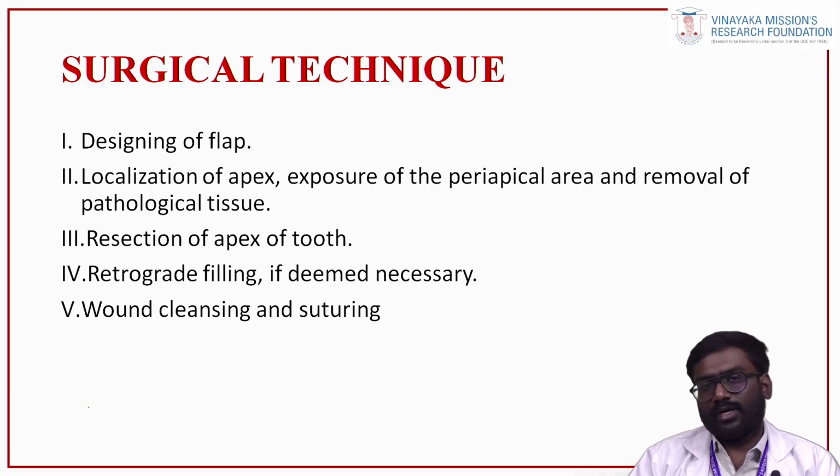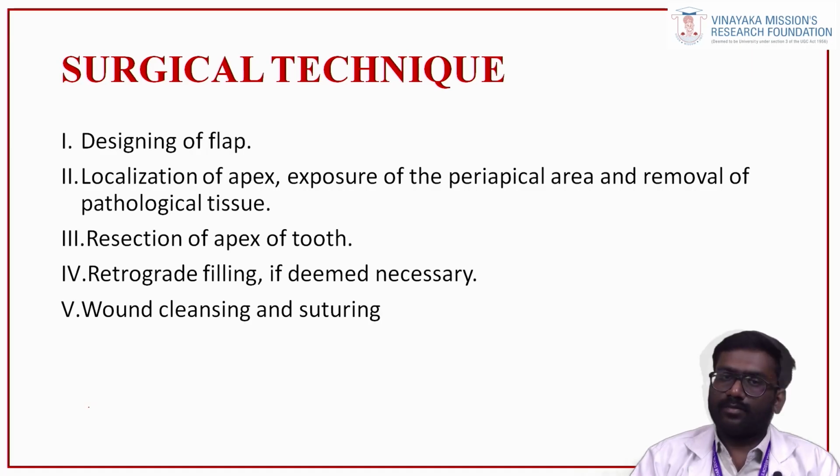Once you have located the periapical region and its contents, the next step is to remove all those infected tissues. Once you have clearly removed them, the next step is to perform a root end resection. After that is the retrograde filling, followed by wound cleansing and suturing.